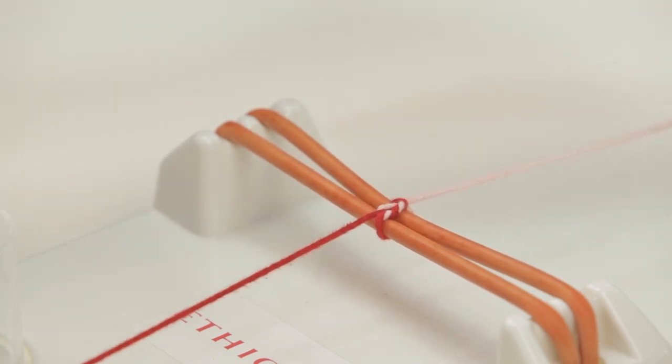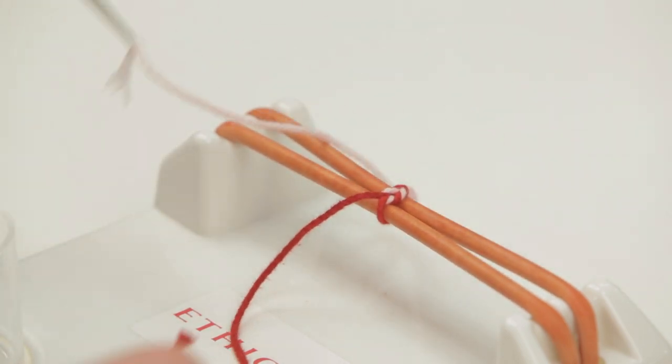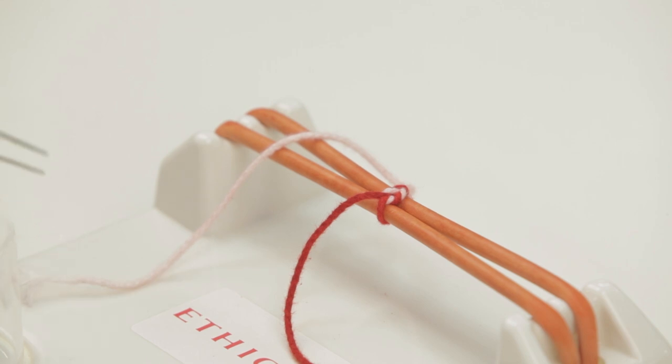This process, like in hand tying, can be repeated over and over to ensure a square and secure knot.